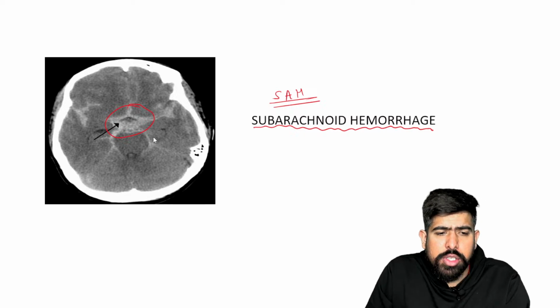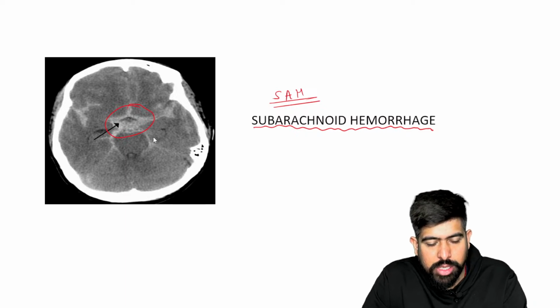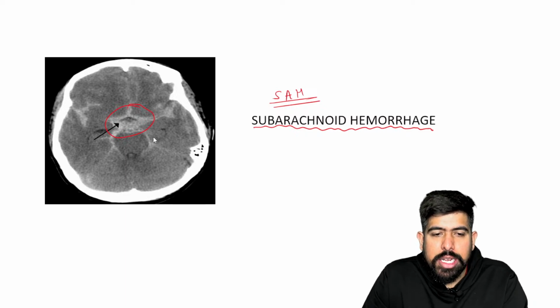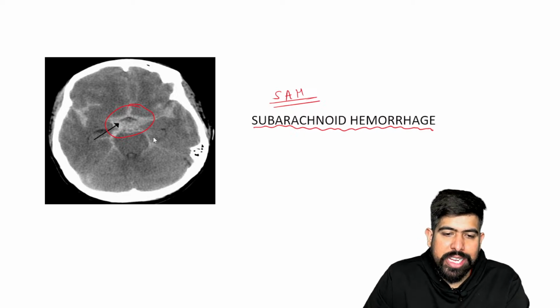Can you see here? This is the brain blood supply. As you already know, the circle of Willis is seen, right? So this is the berry aneurysm rupture. Very good. This is seen in the case of your subarachnoid hemorrhage.